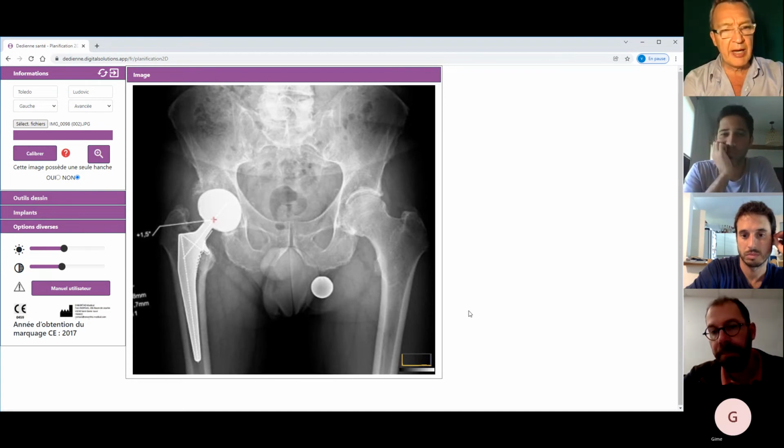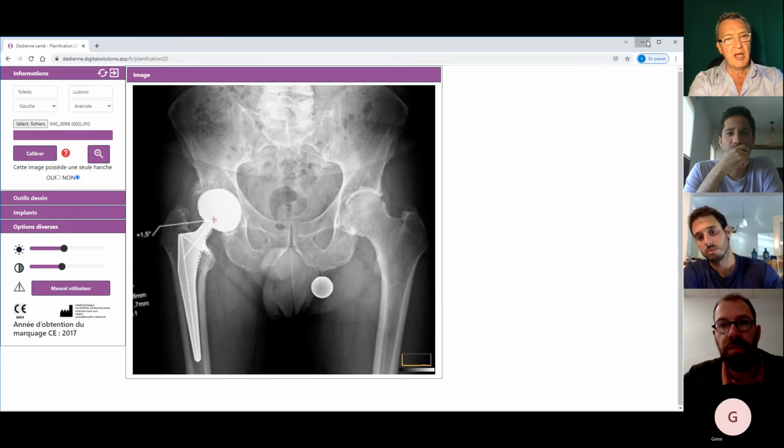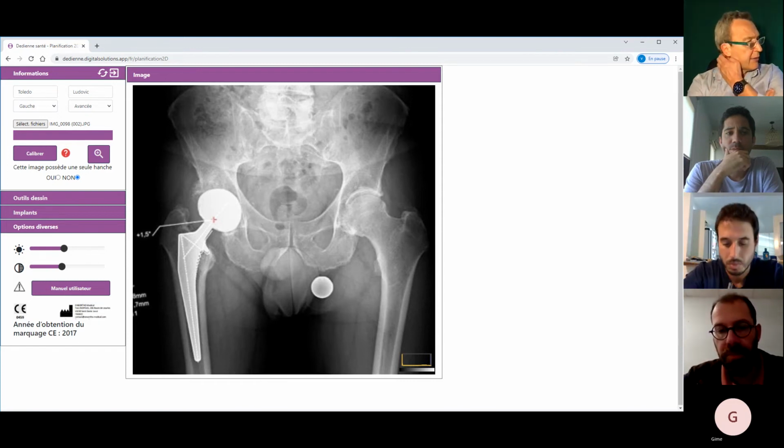Sorry, can we interrupt you in the middle of your talk? Of course. The thing that you upload is a picture. It's a regular picture, yes, JPG or any kind of picture with an accurate calibrator.